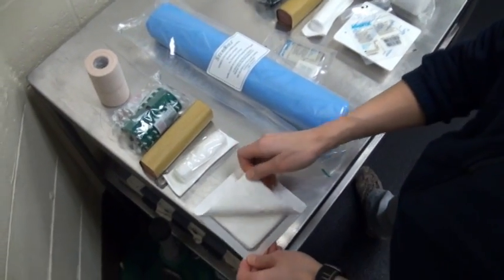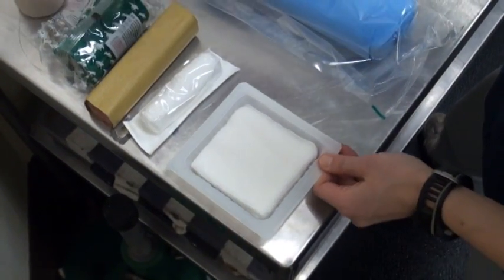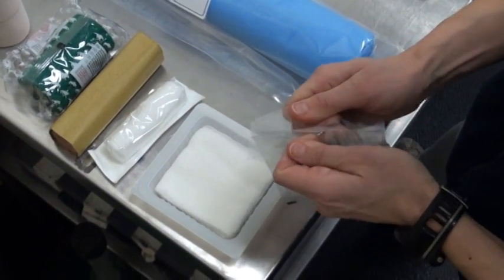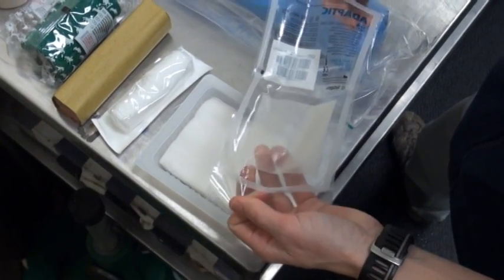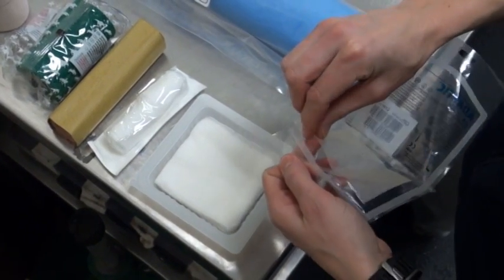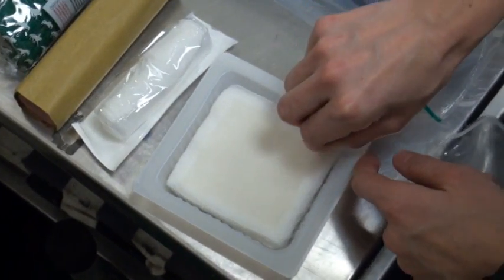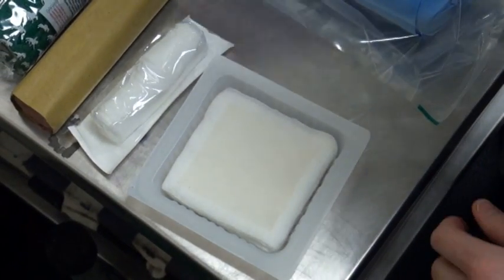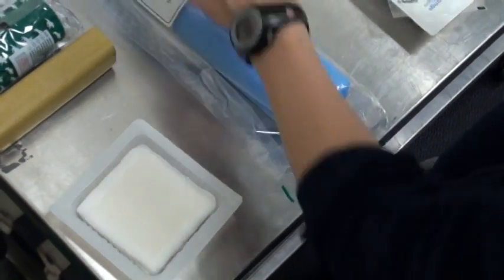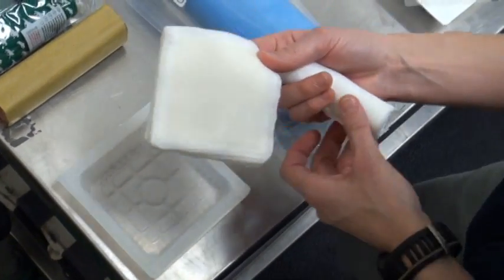So when you go to apply your bandage, you want to try to avoid touching the bandage material as much as you can, so opening it cleanly. The first layers of the bandage that you'll need will be your non-stick bandage that'll go directly against the wound or the sutures, the 4x4s to go behind that, and the roll gauze. So using just a corner, you can lift the sterile gauze and place it on your gauze pad, but again, try not to touch the middle where it's going to be against the horse's skin. This can then be taken gently out of the tray by the corner again to avoid touching the center.